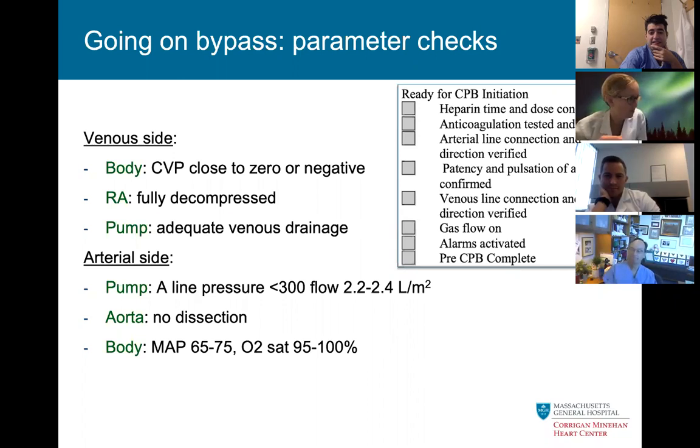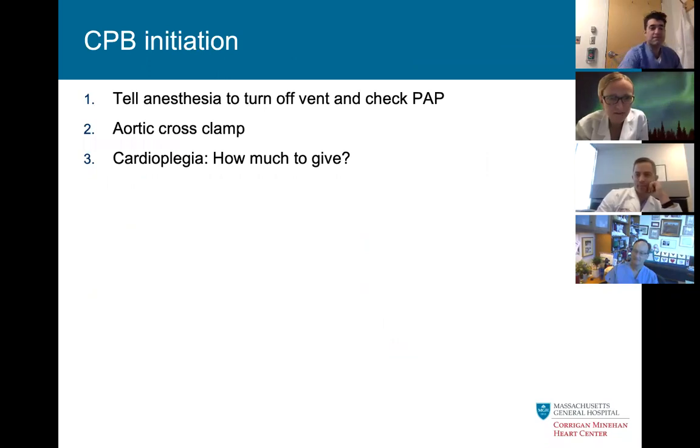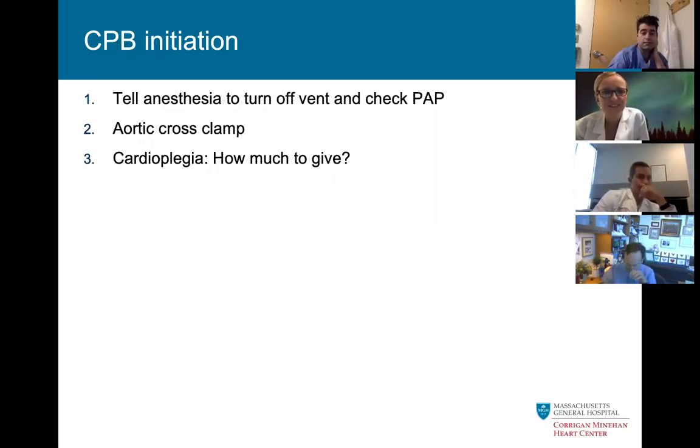The roller pump. The largest part of the picture, probably. Go back to your venous picture. Reservoir. Yeah. So you have all the blood going to the reservoir, and it's going to be stagnant there, and all the blood is going to accumulate there and clot. Immediate death. Got it. Thank you.